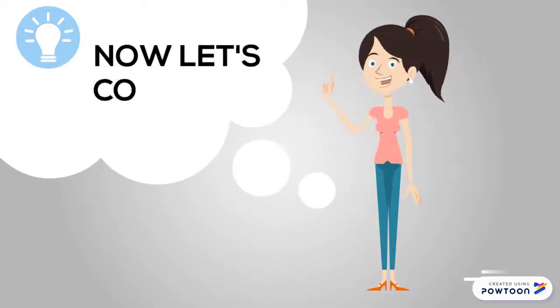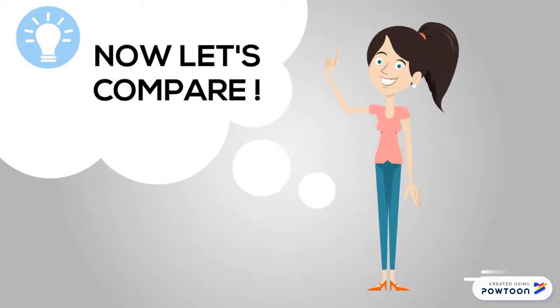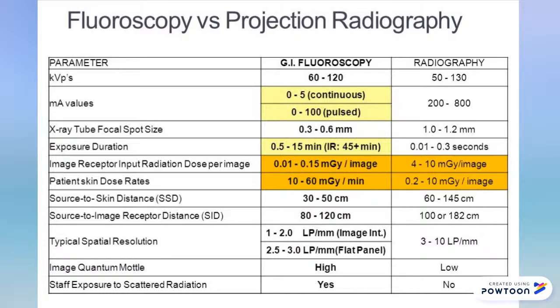Now, let's compare. This is the fluoroscopy versus projection radiography table. The mA values given for continuous fluoroscopy are 0 to 5 mA and 0 to 100 mA for pulse fluoroscopy. However, for projection radiography, it is in the range of 200 to 800 mA.